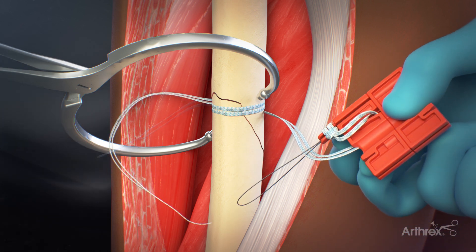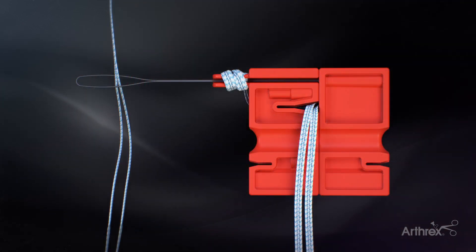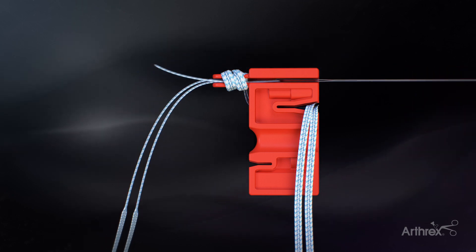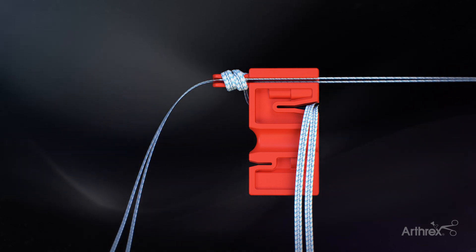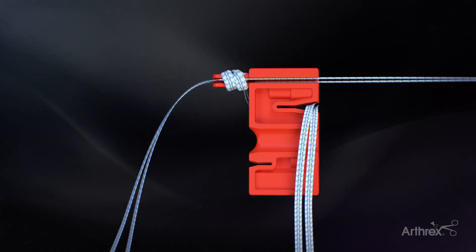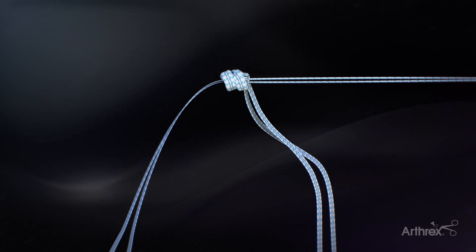Place approximately 2 cm to 3 cm of the fiber tape suture tails into the nitinol loop attached to the loader. Separate the two tabs of the loader, pulling the nitinol loop and the fiber tape suture tails through the knot. Once the tails are through the knot, un-cleat the remaining suture and remove the knot from the loader.